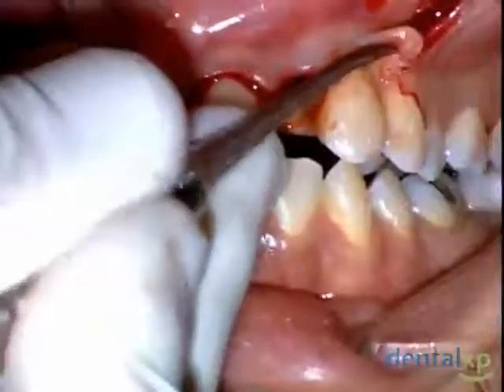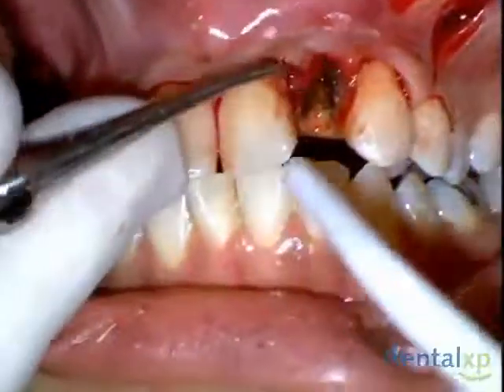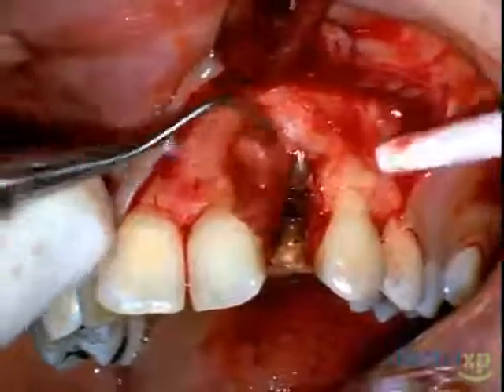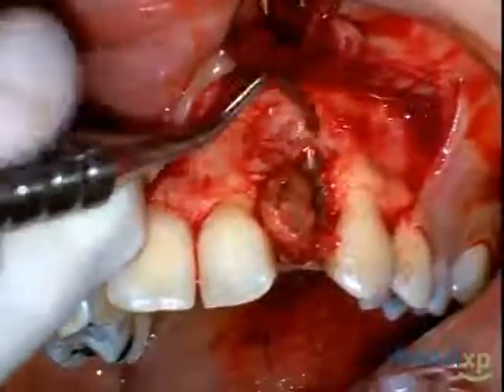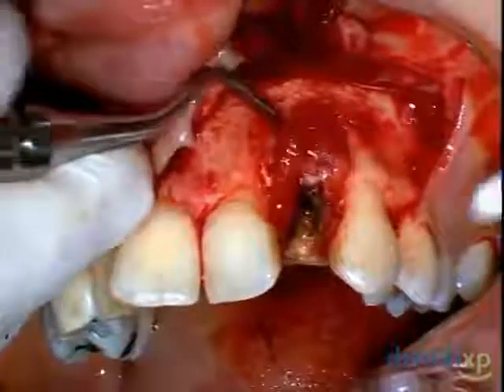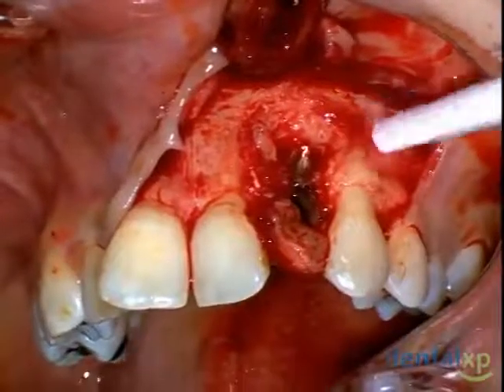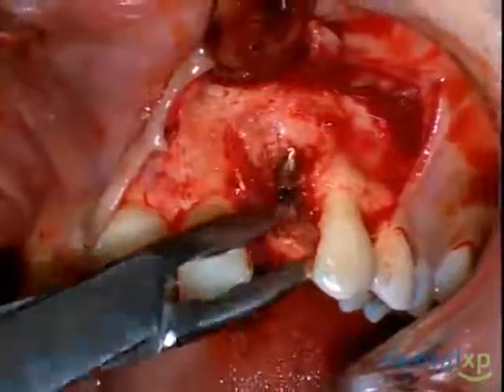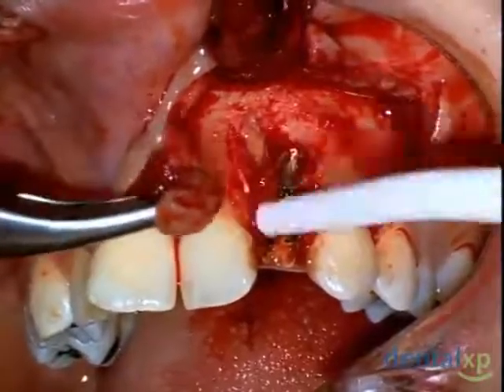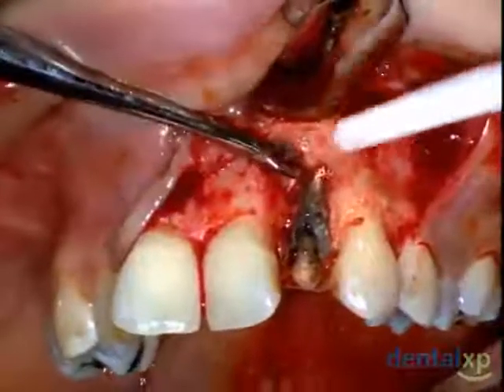This is first done with full thickness dissection, as it will allow me to gain access beyond the mucogingival junction and gain access to the large infection. We're then going to utilize a spoon excavator or back action Rhodes scaler to remove this large infection. And you can see that once we're able to do this, we're then going to be able to access the root and be able to extract it without any difficulty.